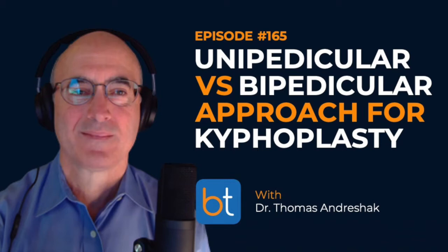That's an interesting question, because really there is no too long for treatment. As long as you have edema on MRI or a STIR image, if you have activity on a bone scan, or you see a fracture cleft on CT, I've treated patients almost a year and a half out that still have micromotion and fracture.